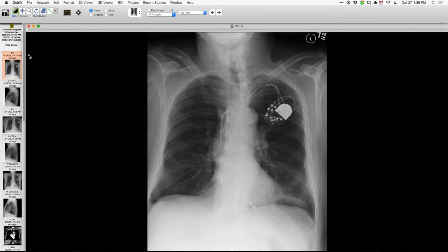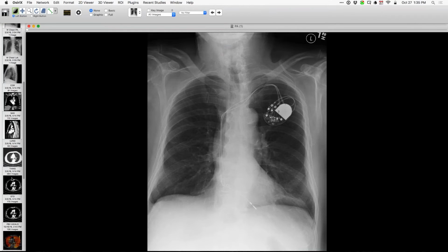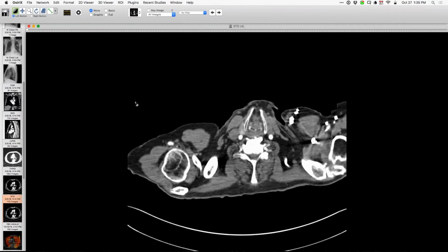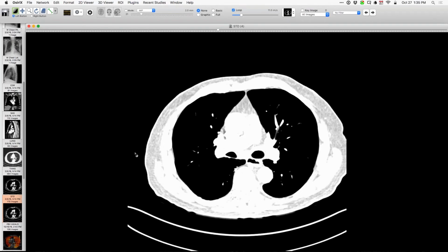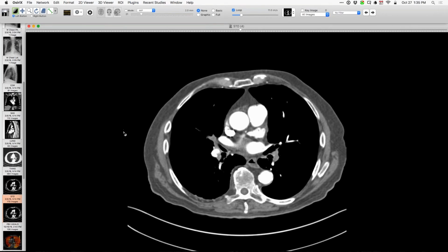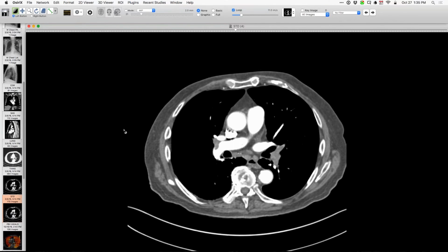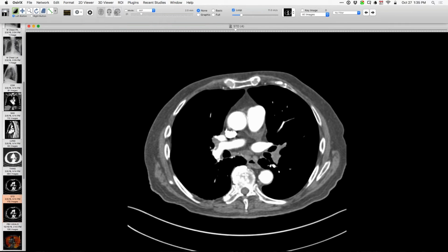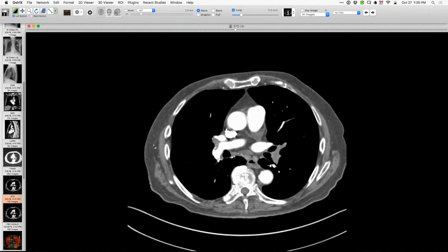Here's a nice example of a patient that had big PE, and I'll show you that. And then the question arises, what's the natural history of PE? Do they always resolve, and so on and so forth? So here's a nice example of an older person with a substantial amount of clot. As far as I know, this is his first episode of pulmonary embolism. A substantial clot burden in the pulmonary arteries, particularly on the left side in the left lower lobe. But you can see there's a lot of clot as well.